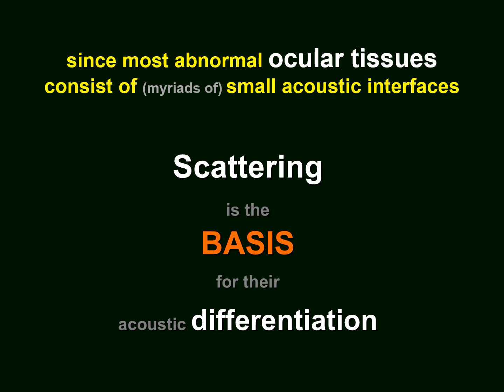It should also be understood that the sound beam reaches a huge number of small interfaces simultaneously, so that a weak but recognizable echo signal is obtained.